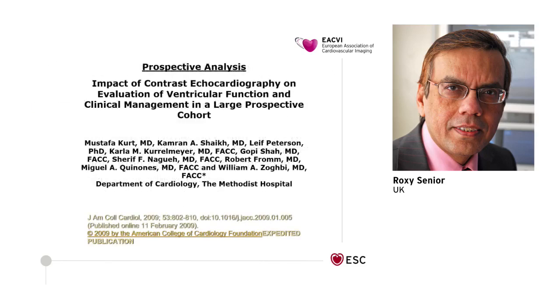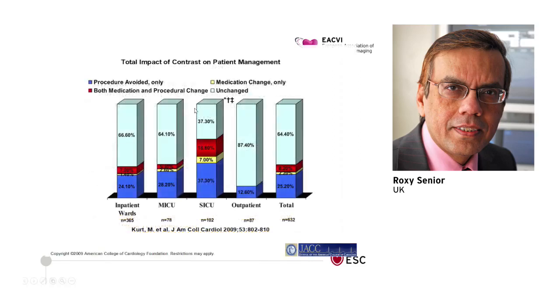So this is looking at the impact of contrast echo on clinical management of patients. And this is a large prospective study, over 600 patients, conducted 10 years ago in the US. This slide looks at the impact of contrast on patient management, with the blue bar showing procedure avoided only, medication change only, or both medication and procedural change. So let's concentrate on the acute care setting, looking at the medical intensive care unit and surgical intensive care unit. And you can see here that in the medical intensive care unit, the changes that were brought about following contrast injection are in the region of 35%.